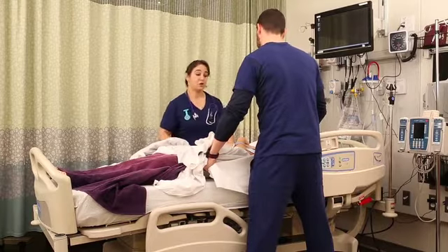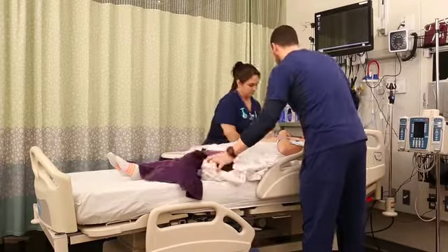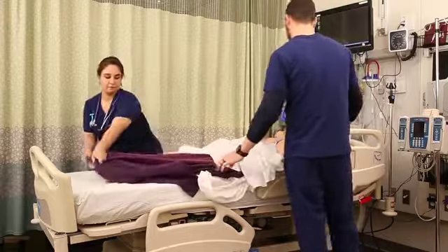On the count of 3, you lift and step towards the head of the bed. The big thing here is you shouldn't be dragging the patient. If the patient's too heavy to avoid that, use Trendelenburg or get more help.